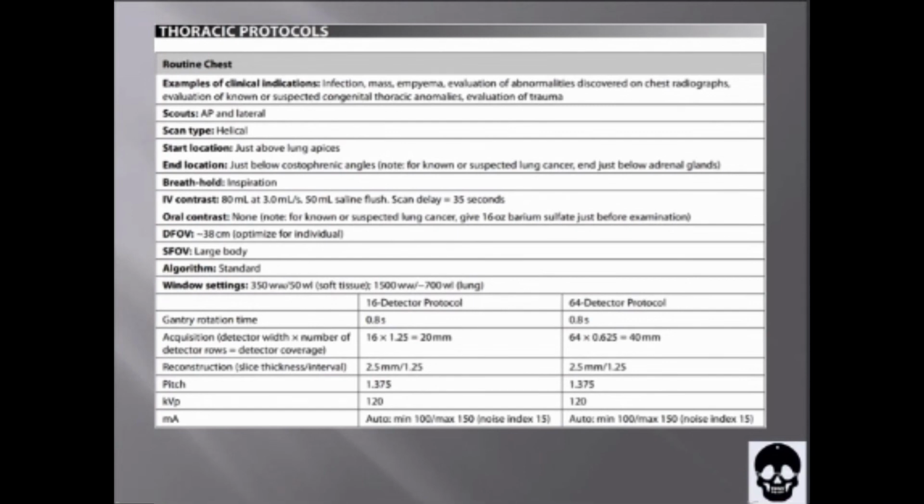700. For the 16 detector protocol, we are using a gantry rotation time of 0.8 second; 64 detector protocol, 0.8 seconds.